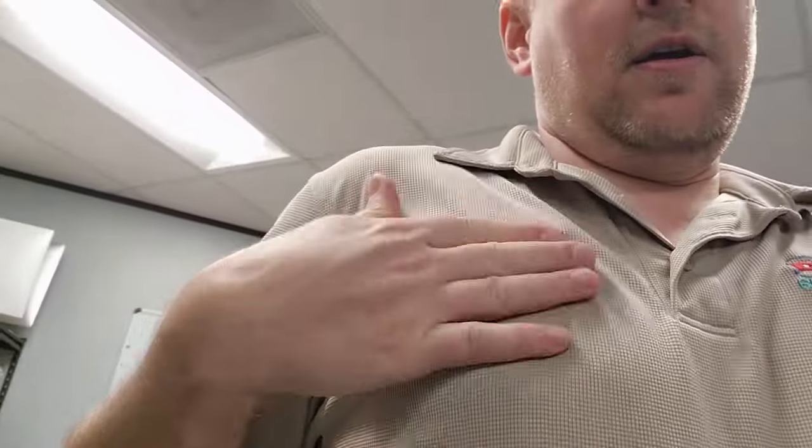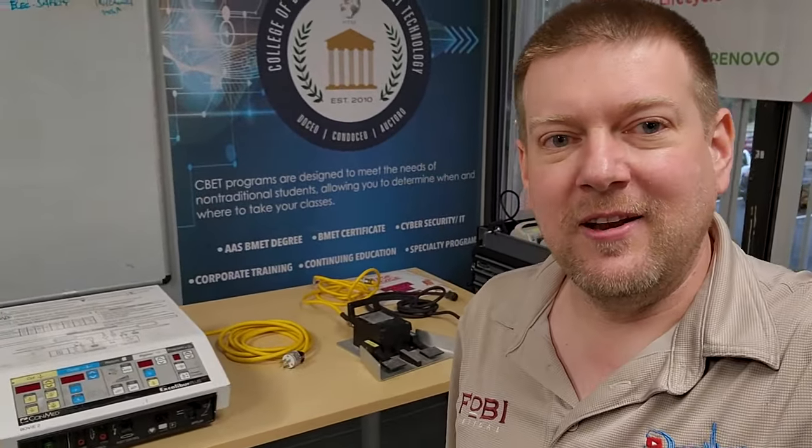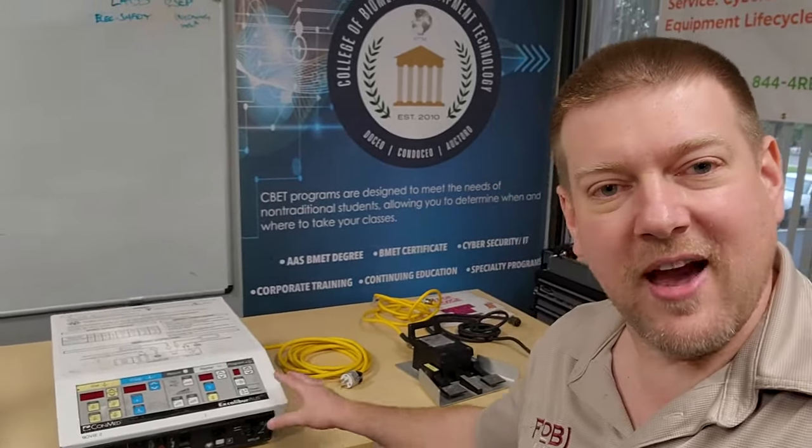Welcome back to Better Biomed. Today is an interesting video covering something you won't do very often but is still a function you provide: incident investigations. When you have an incident, all associated items must be quarantined, and a disinterested party comes in to do the investigation. If you are the biomed who takes care of this device, you should not be the one doing the incident investigation. We're in San Antonio at College of Biomedical Equipment Technology, and we're going to do an incident investigation on this Conmed Excalibur Plus — still a workhorse, still out in the field.